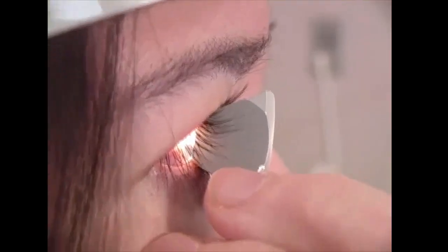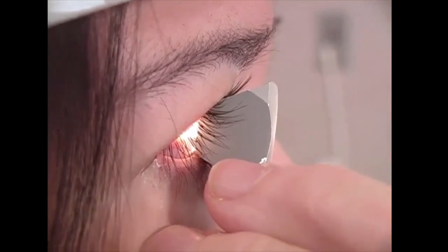And now we have this lens on the eye. You can see there's always a little bit of air flashing under there because I don't want to be pushing. And I can see all four quadrants just that quickly, just by going from mirror to mirror. So once one becomes skilled with this lens, it's pretty easy to use and pretty fast.